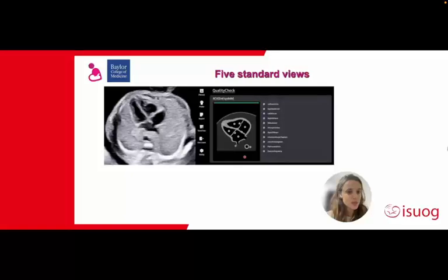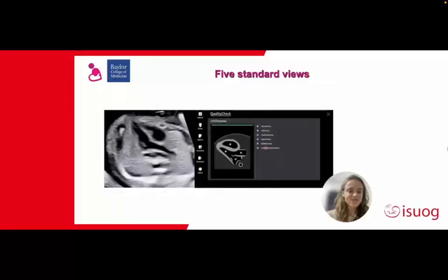However, my surprise was when I saw that I got a yellow for this image, and I didn't realize, but the software did, that actually you cannot see this pulmonary vein in black. Here I couldn't see the second pulmonary vein entering the left atrium. So I must say I was quite satisfied when I saw that the software was capable of spotting my mistake. Let's put it this way.